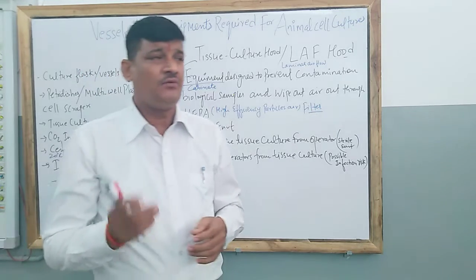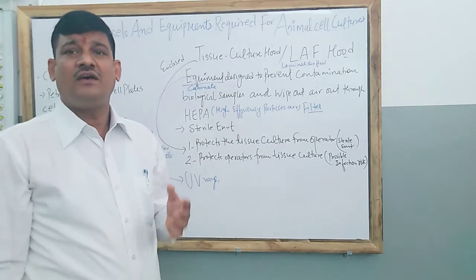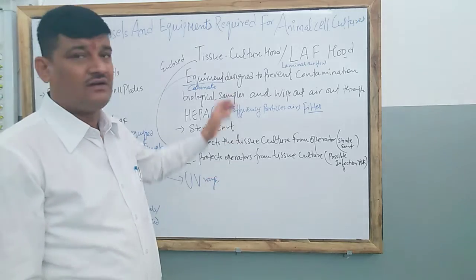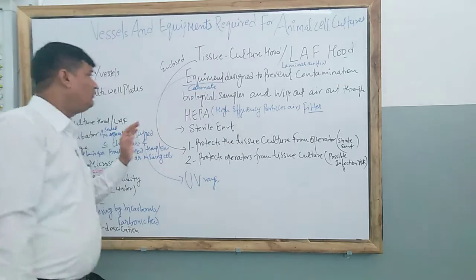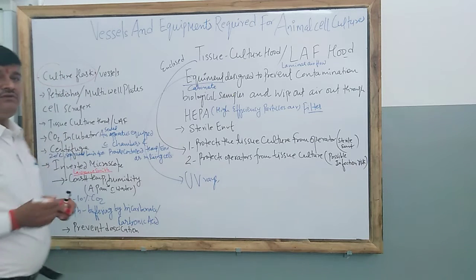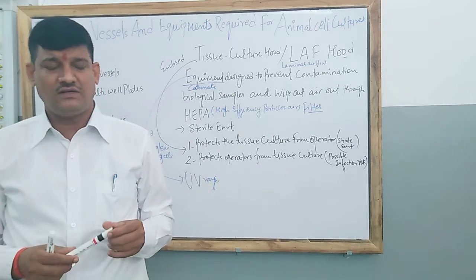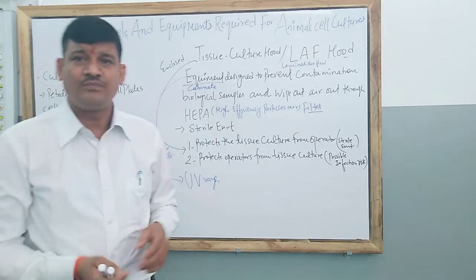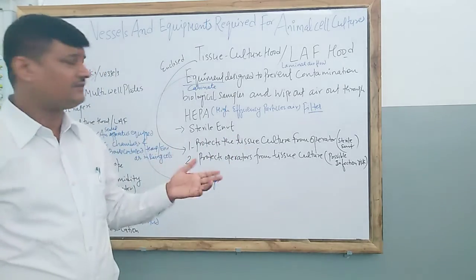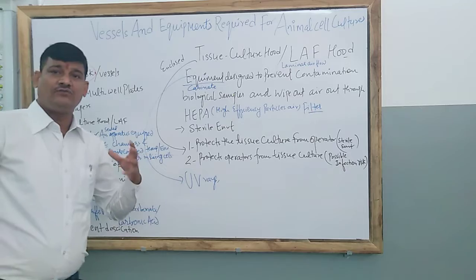Another important thing is the main equipment used in culturing of cells, as follows. The first one is the culture flask. This is the culture flask. You are already aware of the culture flask because we have already discussed these things in the tissue culture technique. Apart from that, the petri dish, you are also aware of the petri dish.